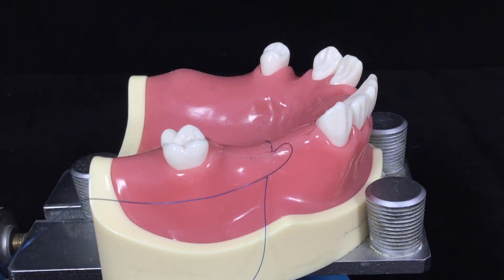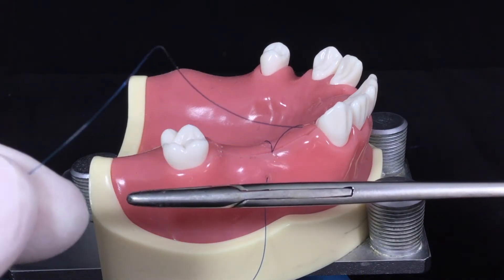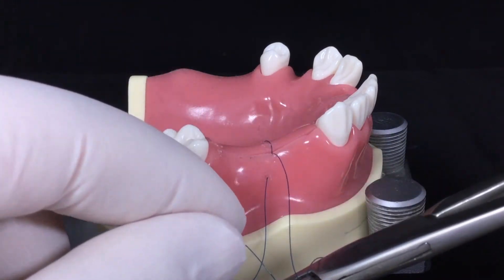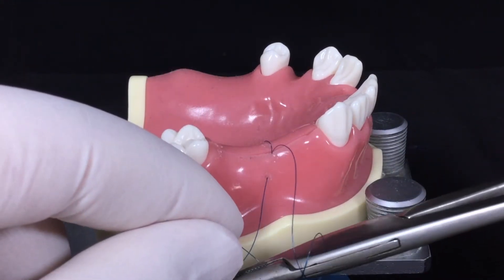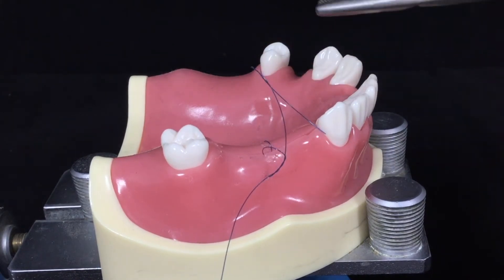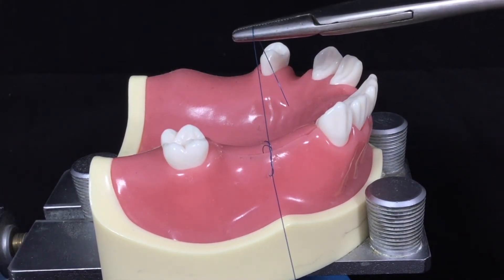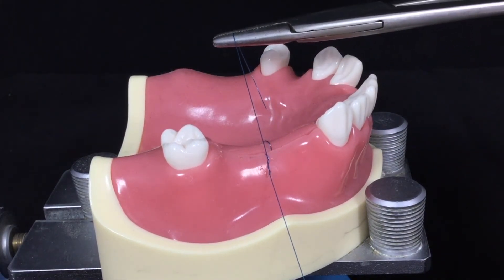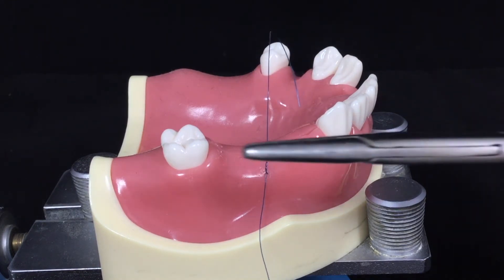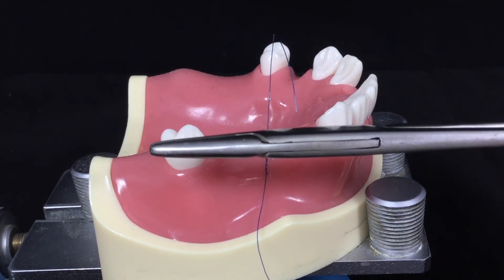The needle holder goes above the river. The long end turns around the needle holder twice. The short end crosses the river. The needle holder goes above the incision line.